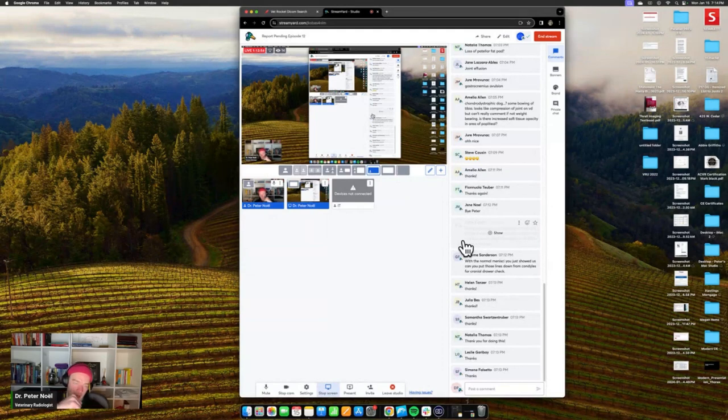Now, again, flex the tarsus, get that lateral view. And in some cases, especially with an acute one where the owner brought them in, that thing will push forward and you'll catch it.